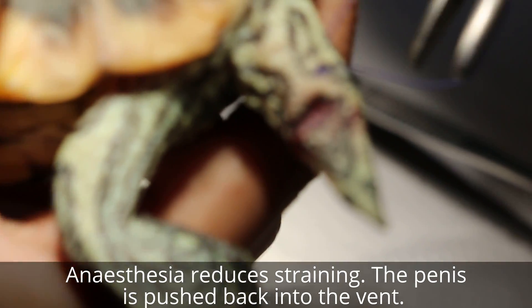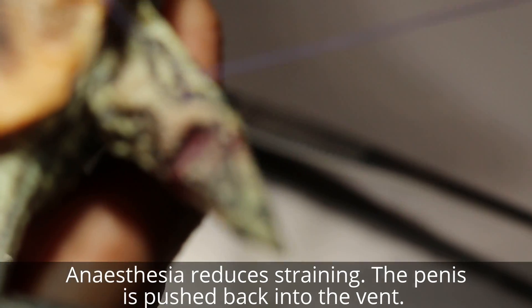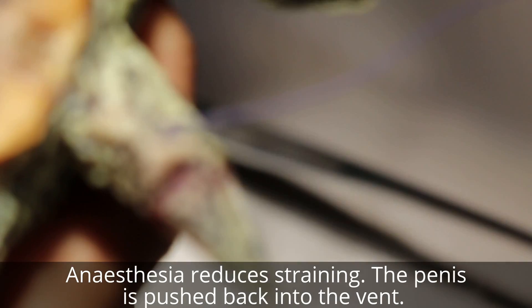So tie five knots - normally in 14 days it will dissolve, so no need to come back for stitch removal.